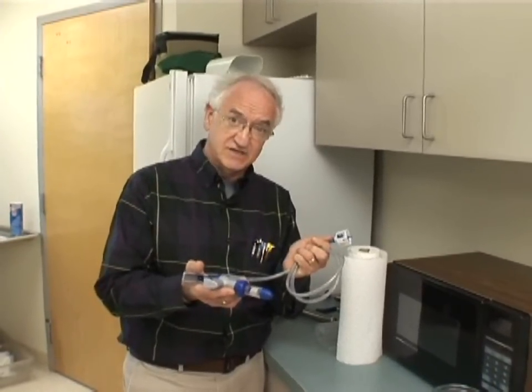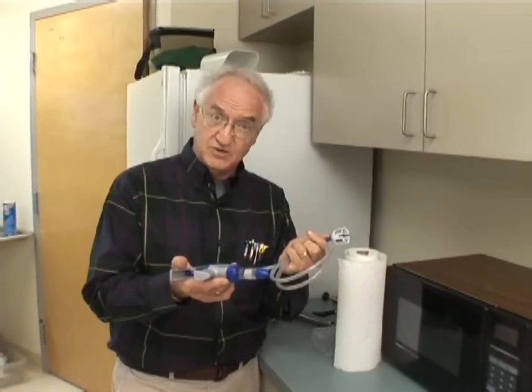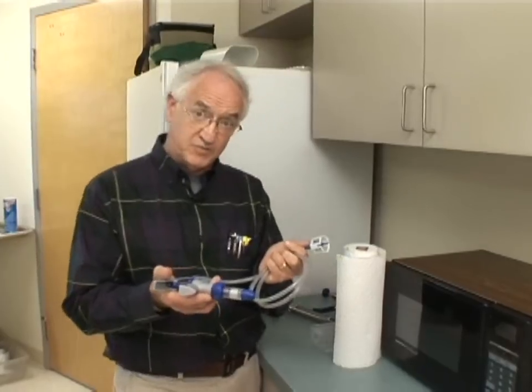We never ever want to use any disinfectants or soaps in any of these syringes that we clean, because of the potential the residues would have an adverse effect on the product that we use.